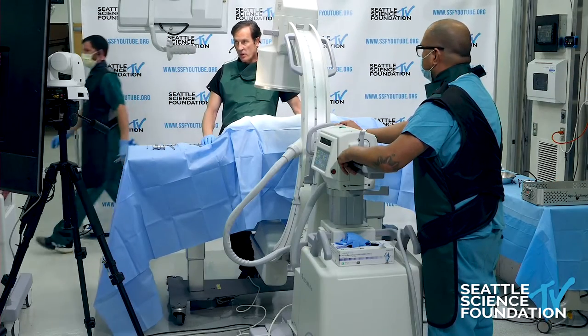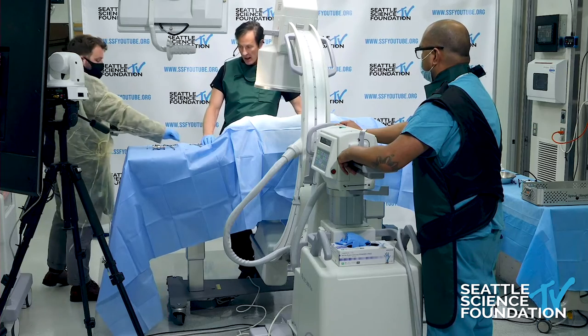So this is an interspinous process fusion device, and the specific device we're doing is the only interspinous process fusion device that we have today — it's called the Minuteman by Spine Simplicity.